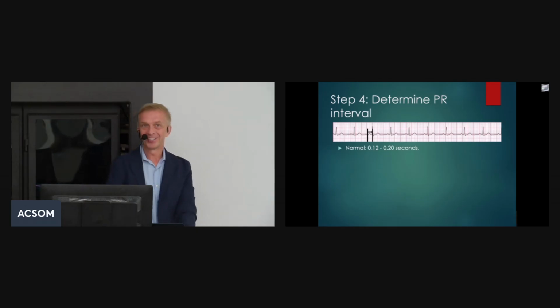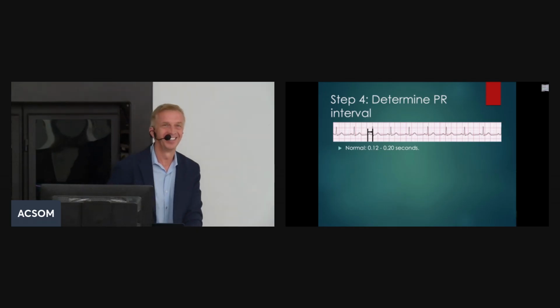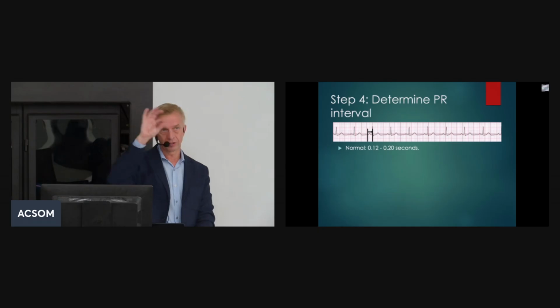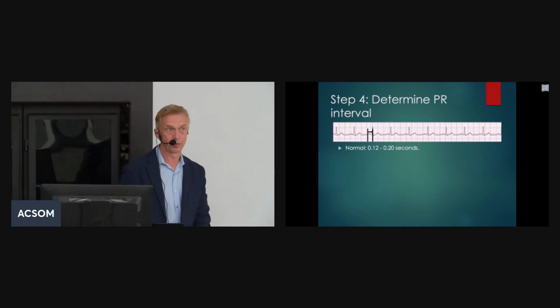Did you look at the internet or what? All right. So yes, Wolff Parkinson White, there is an accessory pathway.